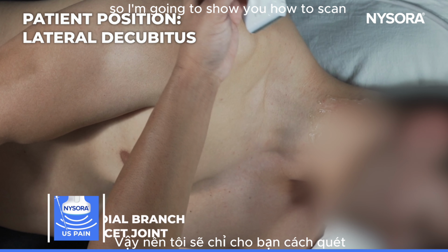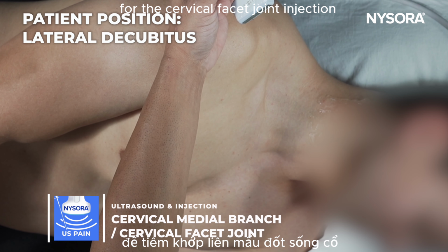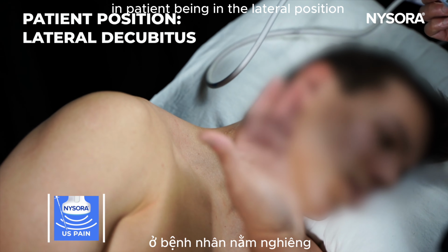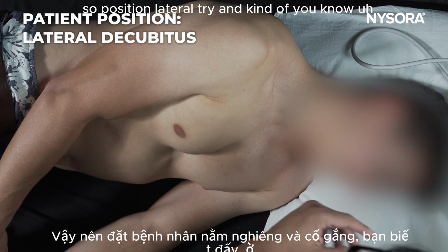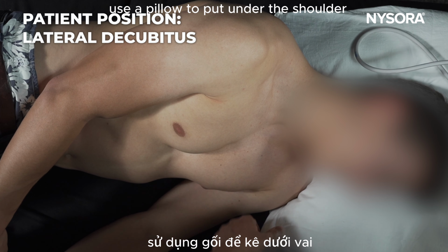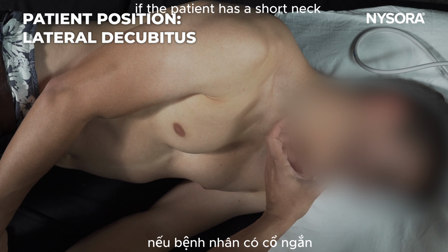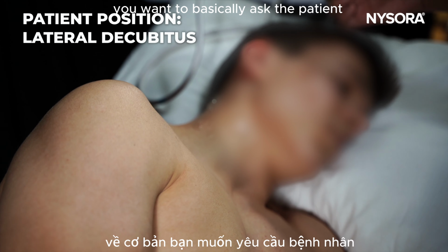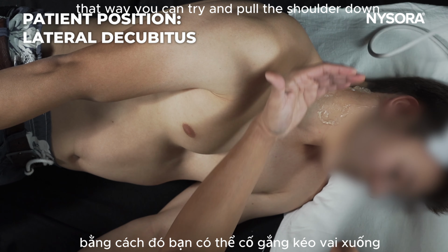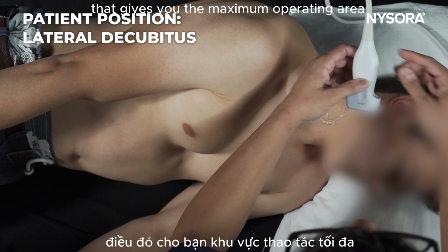So I'm going to show you how to scan for the cervical facet joint injection and the cervical facet joint medial branch block with the patient in the lateral position. So position lateral, and try to use a pillow under the shoulder. If the patient has a short neck, you want to ask the patient to reach out for the knee. That way you can pull the shoulder down. That gives you the maximum operating area.